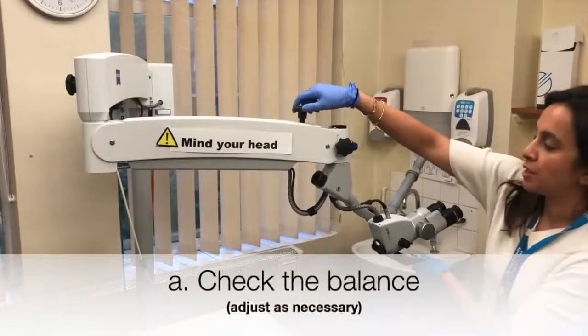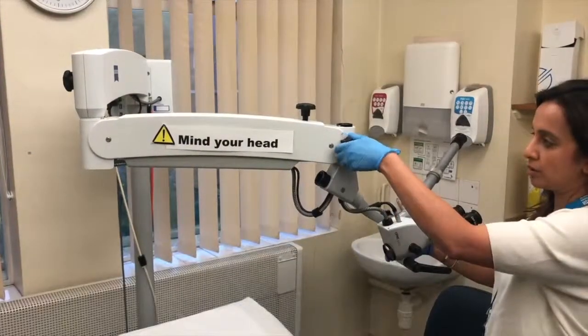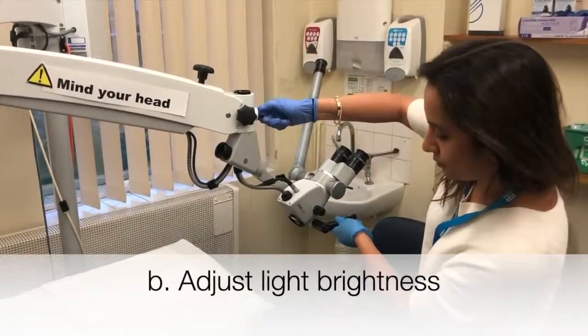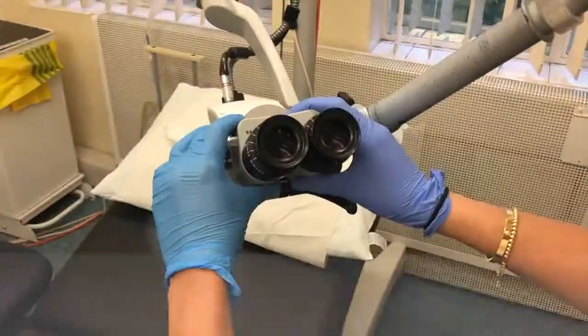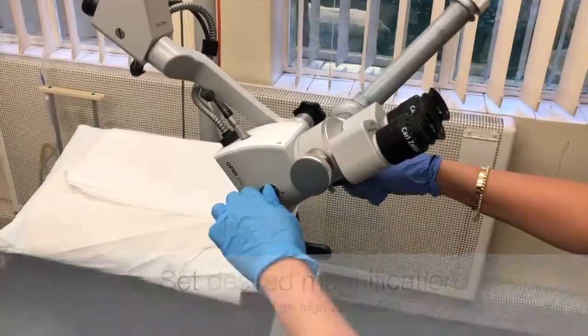Set up the microscope, checking the balance and adjusting as necessary. Adjust the light brightness and ensure the correct filter is in place. Adjust the interpupillary distance and set the desired magnification.